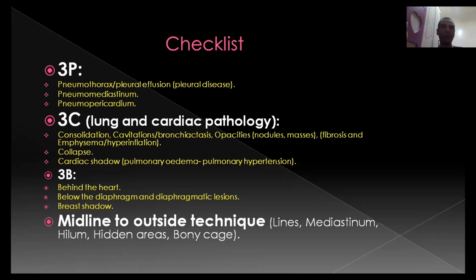It's very easy to clarify if there is any pleural effusion or not, and to clarify the volume of the effusion. But to detect parenchymal disease, CT is better, even MRI couldn't reach it. CT is the gold standard.